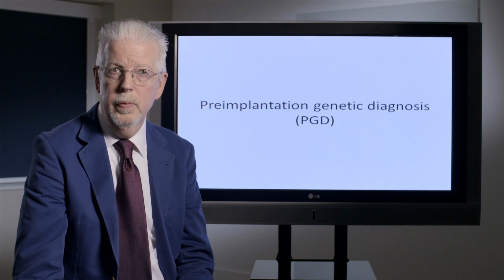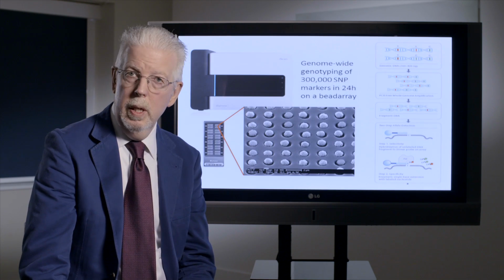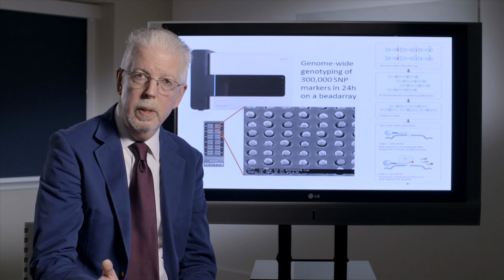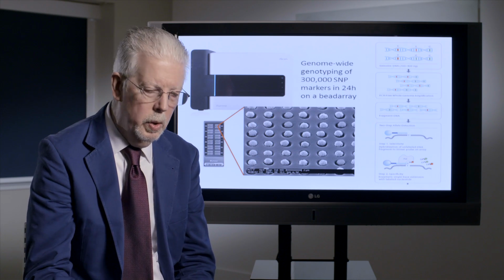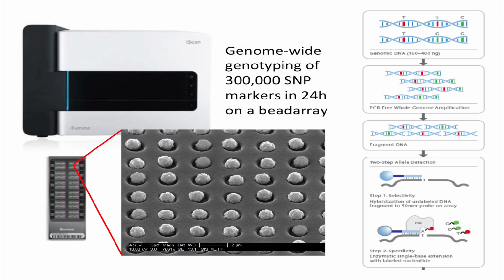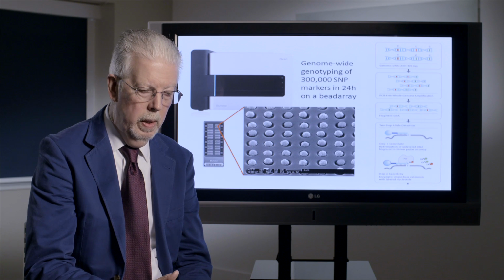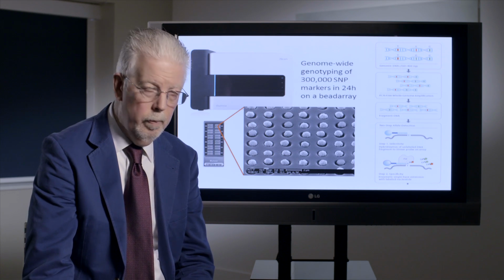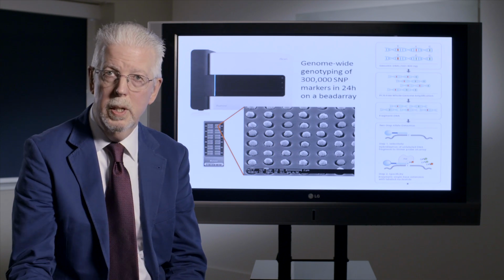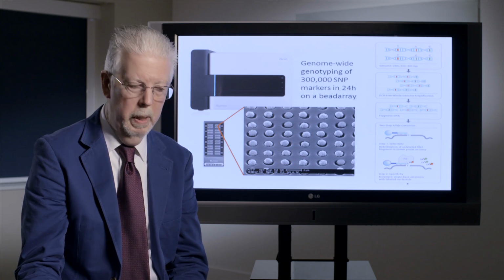So how are we using this technology then for pre-implantation genetic diagnosis? Well, actually, at the present time, we're stepping back and using a microarray-based technique, which is nevertheless extremely powerful. This allows us to analyze hundreds of thousands of markers. These are called SNP markers, so-called single nucleotide polymorphism markers, and these are distributed right across the genome. So in a single test with a single array, we can genotype the markers across each chromosome, across all 24 chromosomes. So this is very powerful, and we can actually do this within 24 hours. So we can do this in time now, because one of the differences between 1990 and now is we have a little more time, as we'll see, because we can now successfully culture embryos to the blastocyst stage.